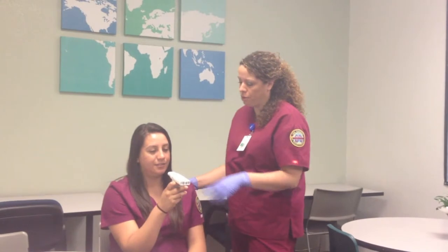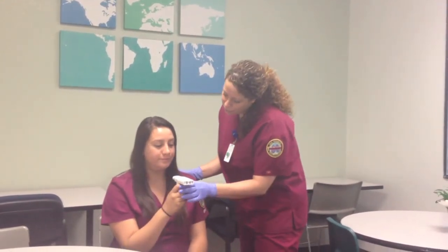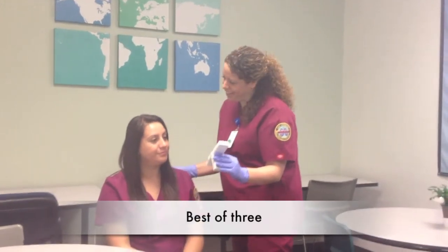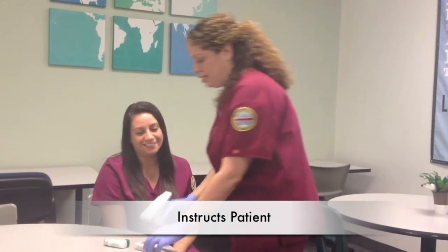Go ahead and form a nice tight seal on the mouthpiece. Breathe in and out. Go! Very good. Thank you. Okay, so we're just going to set this aside.